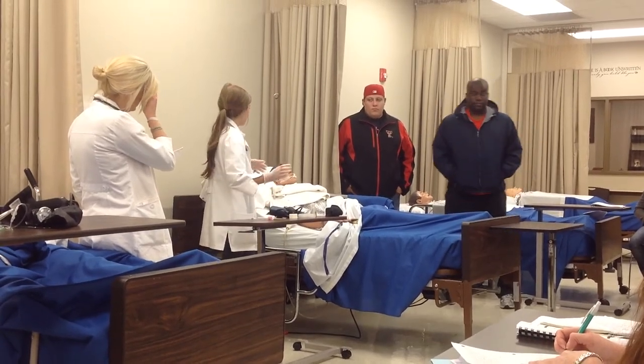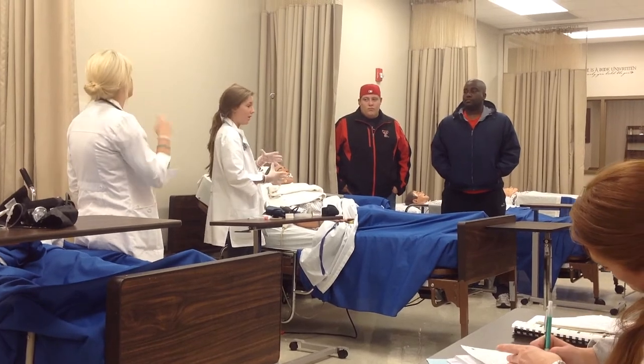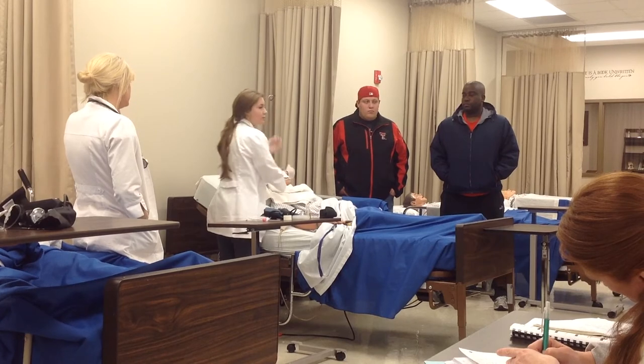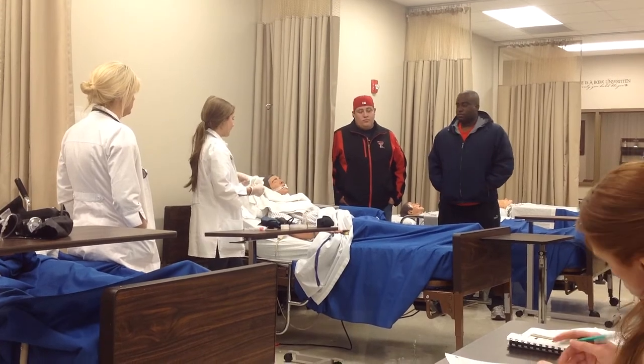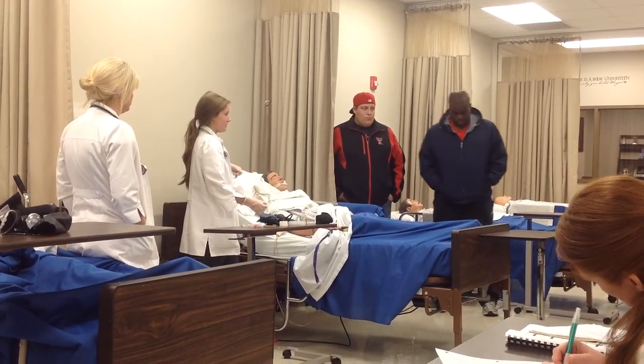And then they're going to be in supine. And if they have a lot of secretions and you just can't get it all out, you can turn their head to the side and put the towel under them so that it'll just drain out, because you can't be constantly sitting there suctioning. But you need to do it as often, and then you're going to clean their teeth as often as you suction them.